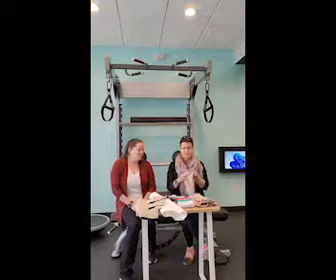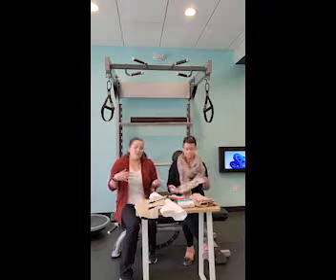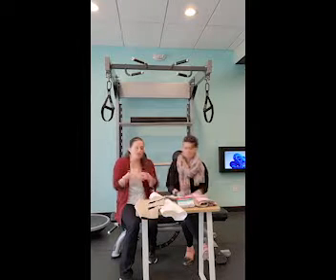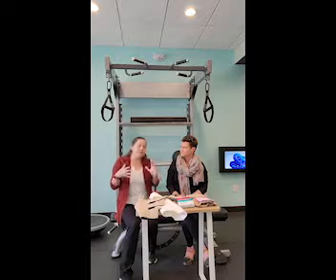So we have a lot of varieties of this, and in many different compression classes. Do you want to talk about compression classes? So some people need different classes. The classes is how strong it is and really how much oomph do you need, right? So we can start off with just a little bit, and if you're still swelling through it or noticing that you're getting a more swollen hand, we can up the compression class.